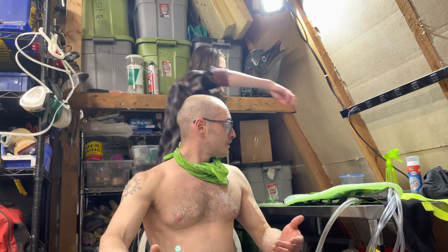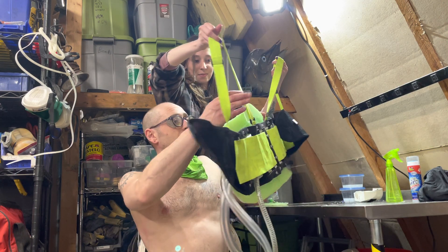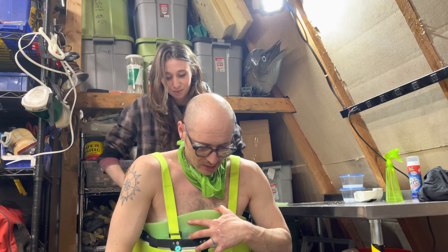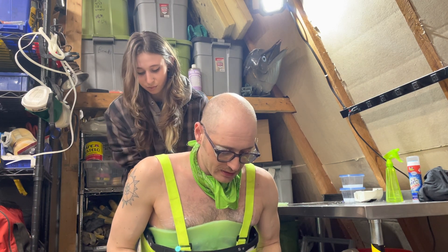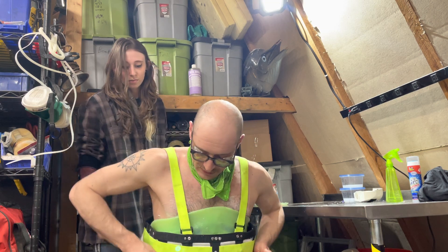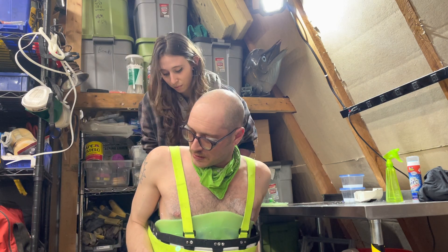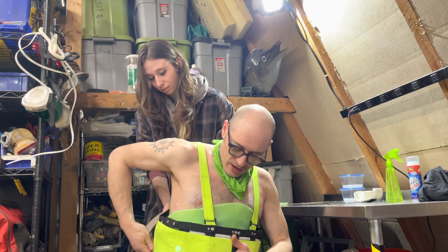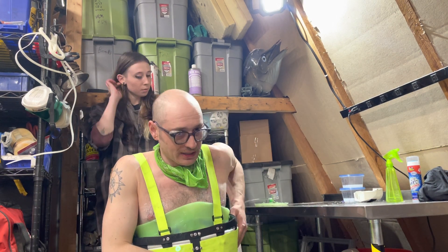I'm going to pretend I'm in the chair. Somebody will help me get one arm in, the other arm in, and lean forward. It gets tightened quite a lot in the back. These straps can be used to adjust a little tighter. The straps in the front can also be used to adjust tension, so they should kind of be neutral tight.